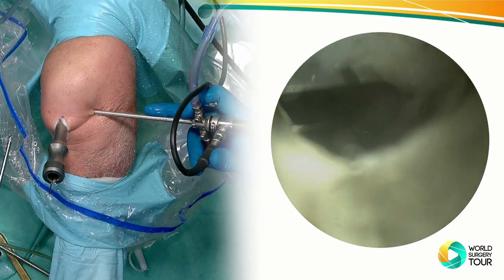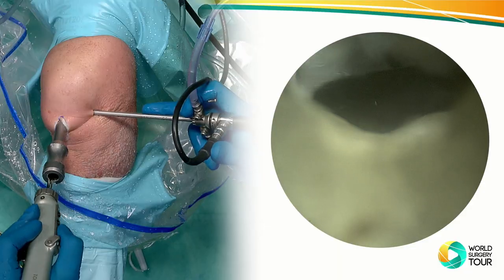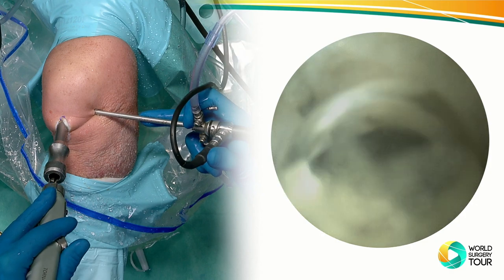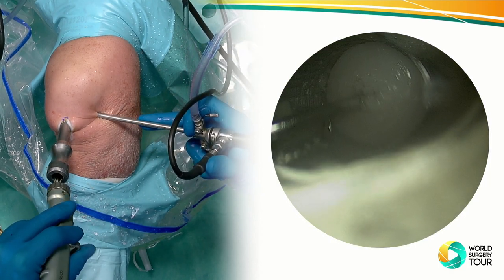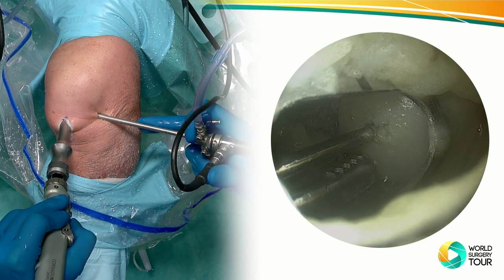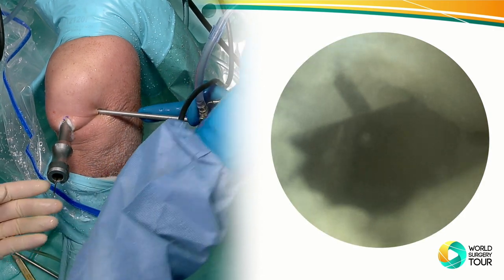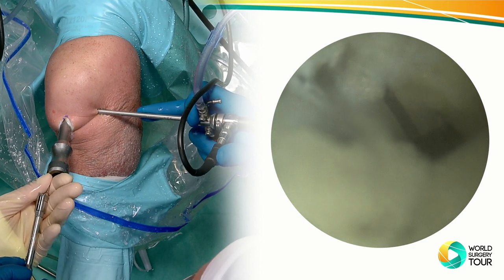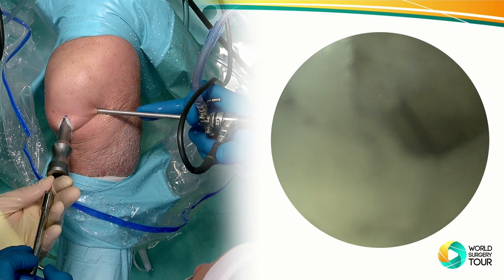Okay. So slowly removing the fluid. Now it becomes dry. Super. And now we need to have the cartilage harvester. Again, it's going to be inserted over the wire. Yeah. Okay.